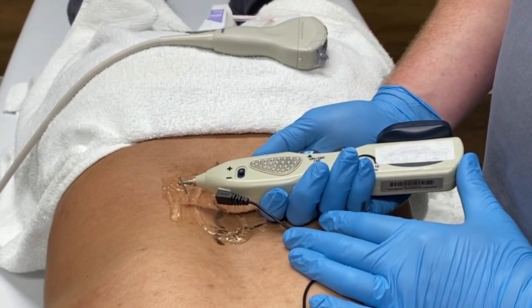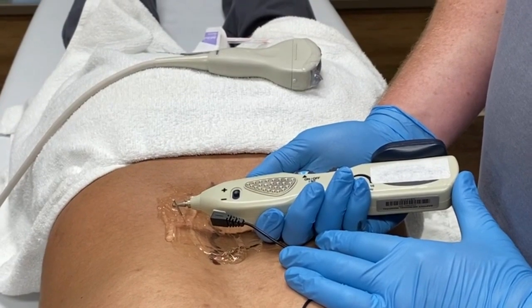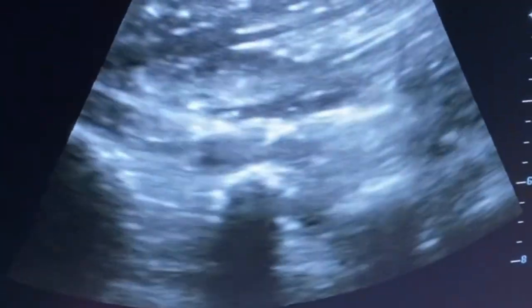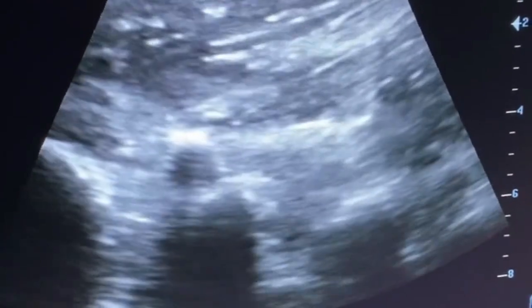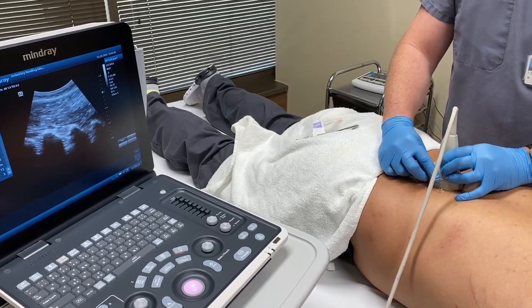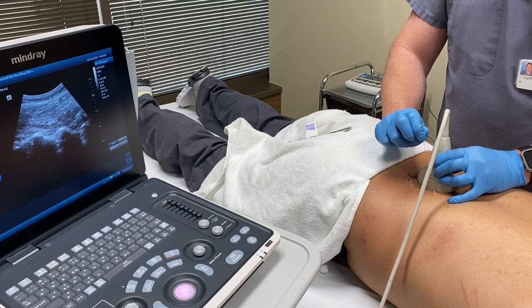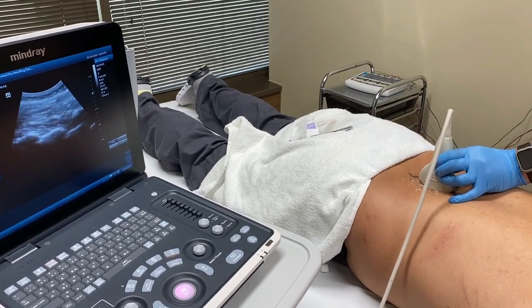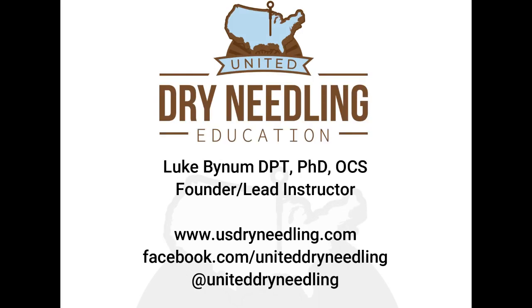Now you can see that 100 millimeter needle, and I'm putting a little E-stim on it. He is not complaining of any nervy-type sensations — all he feels is muscle contraction and the achy radiating referred pain. With the electricity you can see all the movement of the more superficial erector muscles and multifidi, but you can also see movement in between those transverse processes — we know we're all the way down into the psoas. It really shows you how long this needle is when you see me start to remove it — it just never stops coming. That was a 100 millimeter needle, all the way through the multifidi, in between the segments, and down into the psoas. Because psoas is so deep, I really think the only safe way to needle it is with real-time ultrasound guidance, so you can know exactly the depth you're going without penetrating something you don't want to puncture.